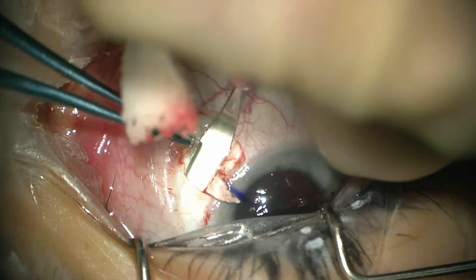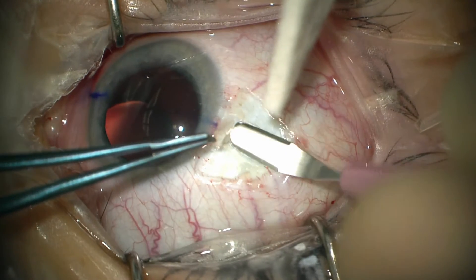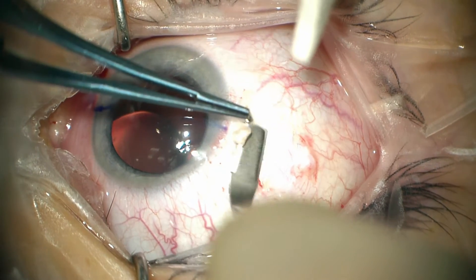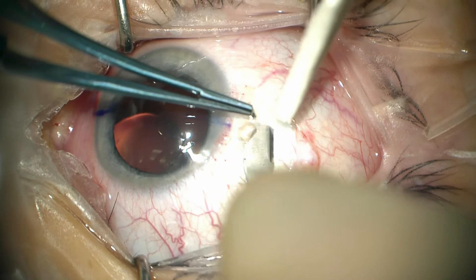I found that this is easier, and since we've changed to using an Aaron Scientific EC3 lens with very soft, flexible haptics, it tends to go into this pocket without a problem. Again, we're making a pocket here with the crescent blade in the other flap in preparation for tucking of that haptic.